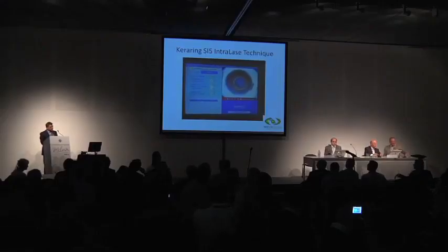And this is the SI5 technique, using the IntraLase. There is no doubt: my parameter is 80% of the corneal thickness in the area of implantation. I really like to have very tight channels. If we really want to achieve the corneoplasty concept, I suggest using tight channels. So I use 4.8 inner diameter and 5.3 outer diameter, an entry cut length between 0.90 and 1 millimeter, and as many have mentioned, I use the steepest meridian to complete the dissection.